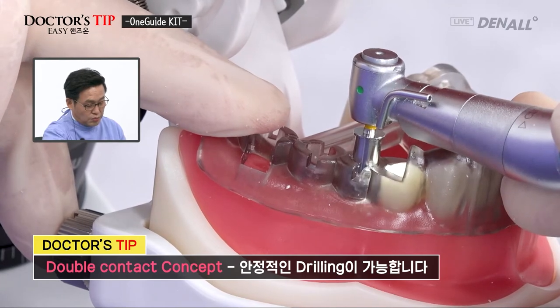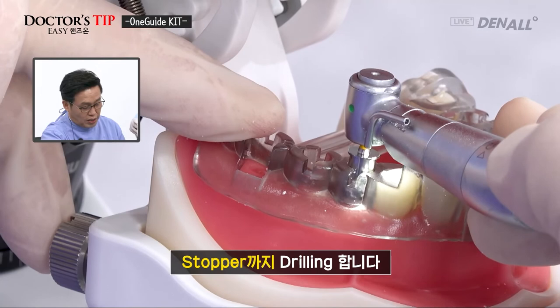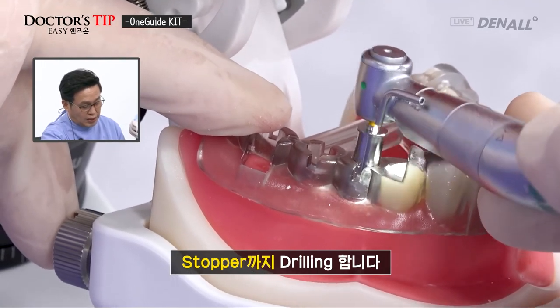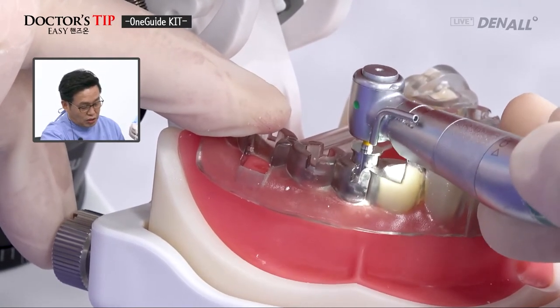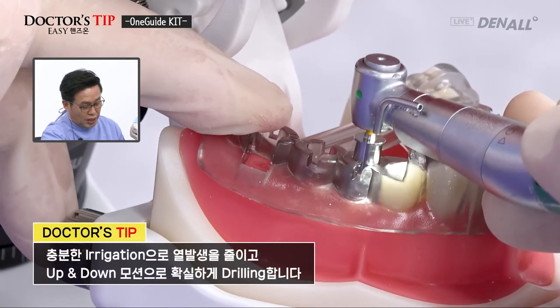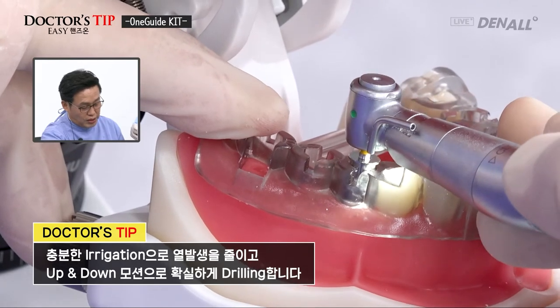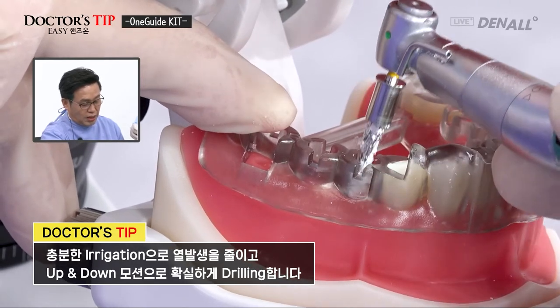Drilling can be done like this. We go in full length. Of course, it cuts well, so it does not generate a lot of heat, but you need to do a lot of irrigation and do an up and down motion to drill full length.